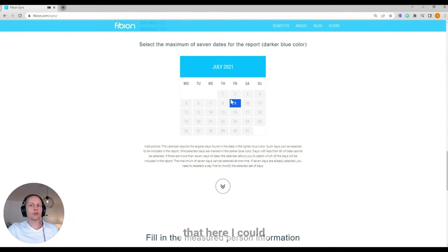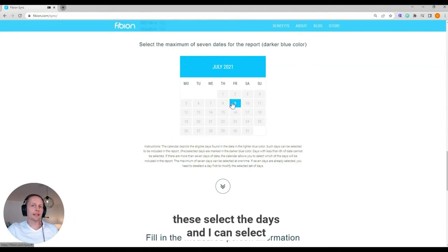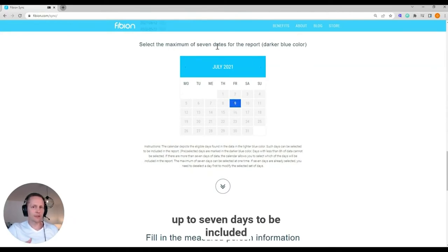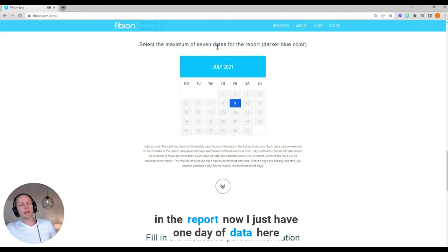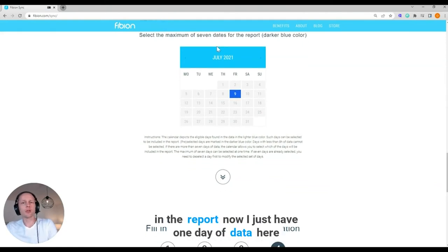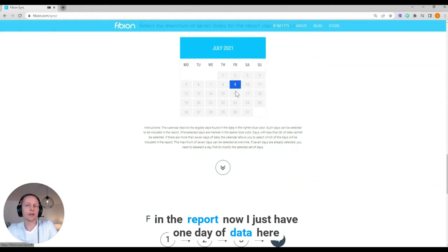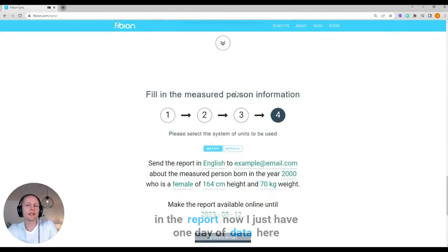Here I could deselect the days and I can select up to 7 days to be included in the report. Now I just have one day of data here.